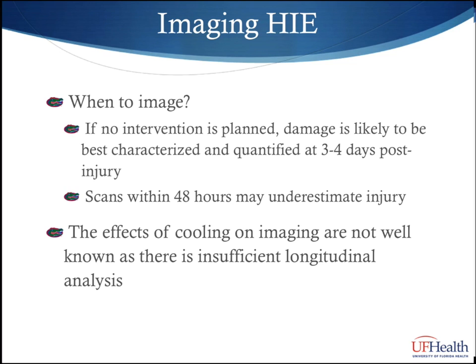Well, if there's no intervention planned and the presence of an acute injury will not alter the management, the damage is likely to be best characterized and quantified at 3 to 4 days post-injury. While you may detect the presence of underlying HIE earlier, the scans within 48 hours often underestimate the amount of injury. Based on these points, we would recommend imaging ideally be performed at 3 to 4 days if the characterization of the extent of injury is the desired goal.